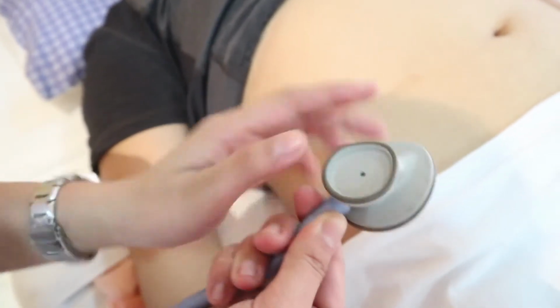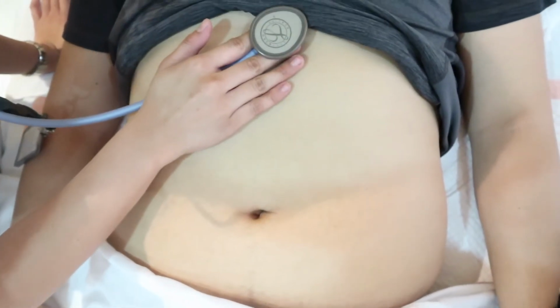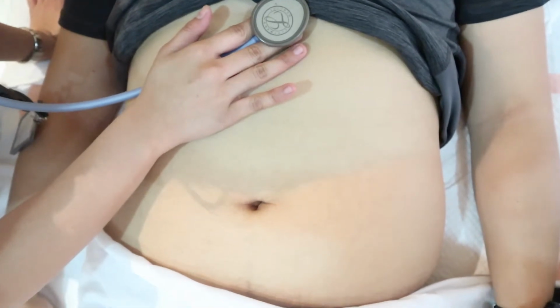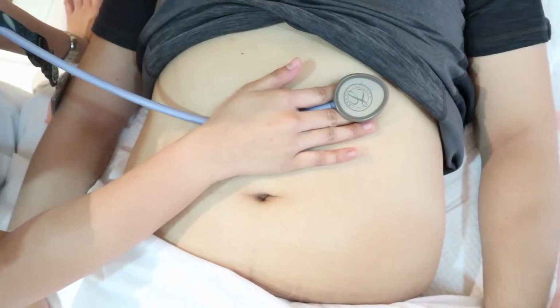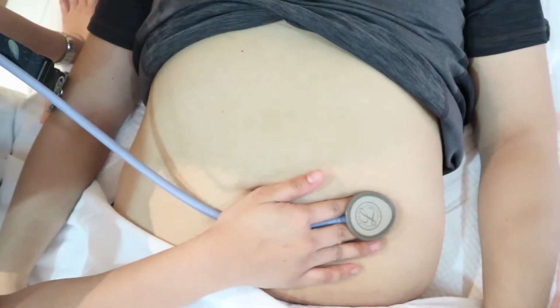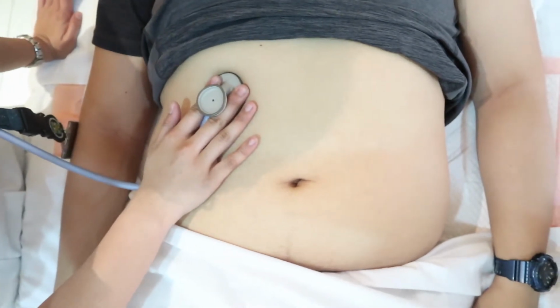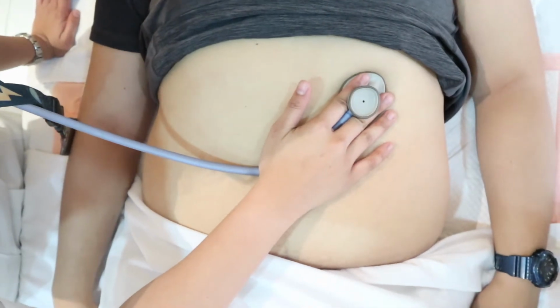Then auscultate for the vascular sounds. Using the bell of the stethoscope, apply light pressure beginning at the middle line below the xiphoid process. Then proceed to auscultate the renal arteries, iliac arteries, and femoral arteries. For the friction rub, use the diaphragm of the stethoscope. Place it lightly over the right and left lower rib cage.